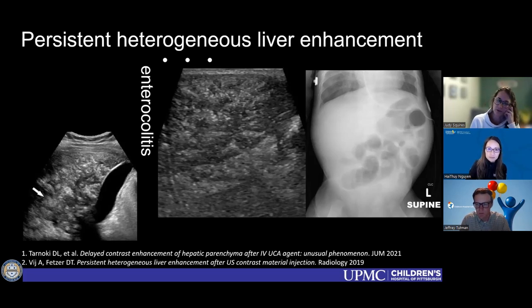Yeah, I know in the adult world, specifically in the setting of inflammatory bowel disease, they compare the time intensity curve at presentation and then at 6 weeks, I think, which is the most common time point following therapy, to see the change over time. There are no absolute cutoff values that I'm aware of, and at least with the software on my machine, the peak enhancement value is kind of meaningless. The rate of enhancement is more important.